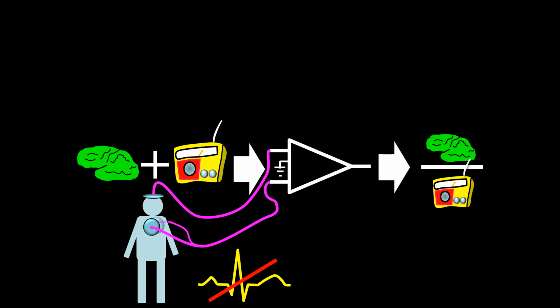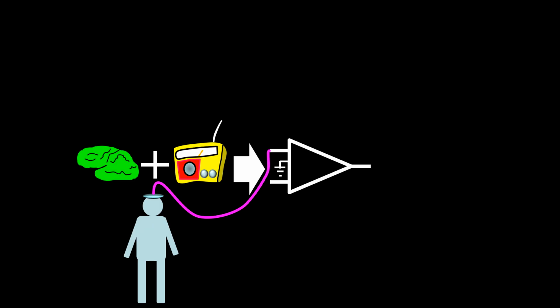But the search for a perfect place to put the reference electrode, that is the one that goes on input 2 of the amplifier, did not end there. Shortly after the last experiment, some early investigators decided to place the reference electrodes somewhere in the head region, but as far as possible from the cranial vault, let's say an ear or both ears. These electrode positions greatly improve the ability to produce an artifact-free epoch.